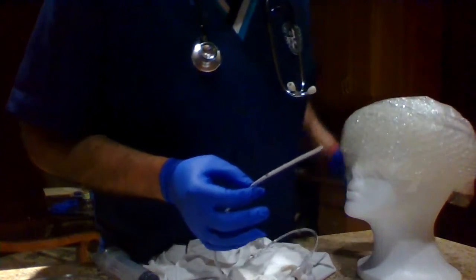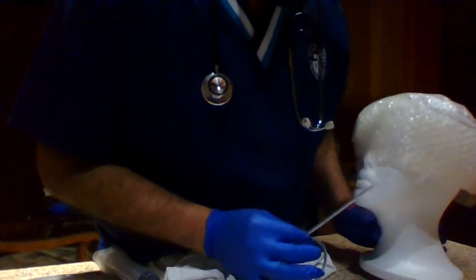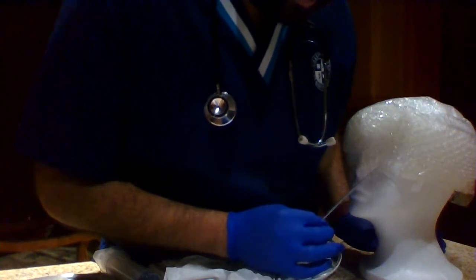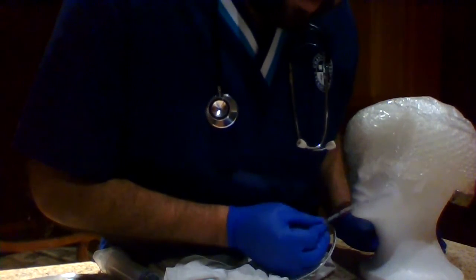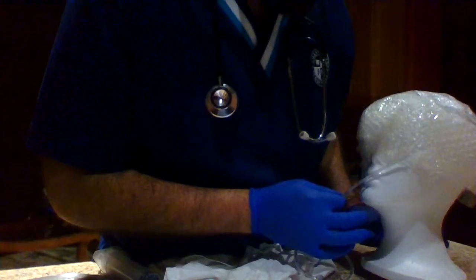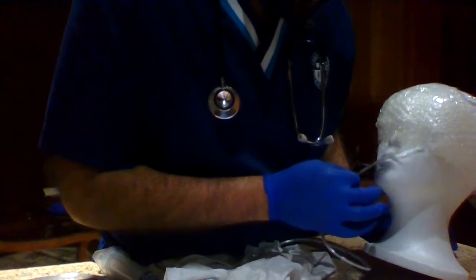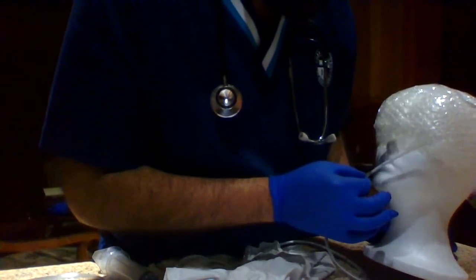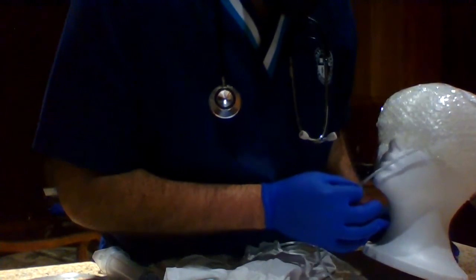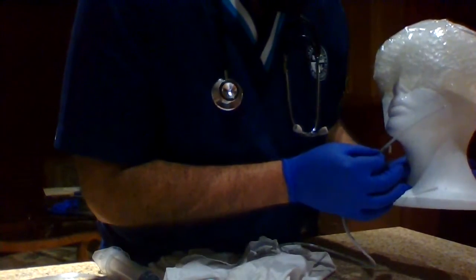So again, with their head tilted back, it's going to be hard with one hand. We're going to gently start to insert it slightly. We first ask the patient to tilt their head back, and gently insert the tube through the left naris. When the patient starts to gag, you pull back a little bit until he or she stops. Then once you have it in there, you ask the patient to tip their head forward.